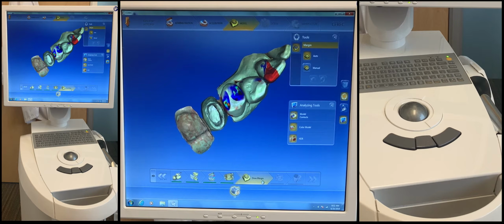Now, I definitely look for high quality, well above the standard of care. But occasionally it doesn't look ideal. And so don't beat yourself up if it's not ideal, as long as it's clinically acceptable, all the caries is removed, and you're going to yield a long-term restoration for your patient.